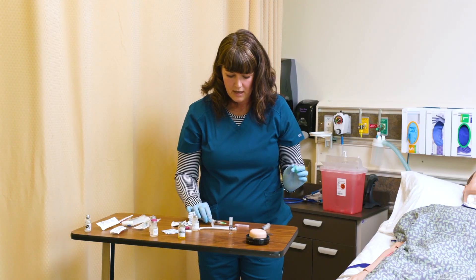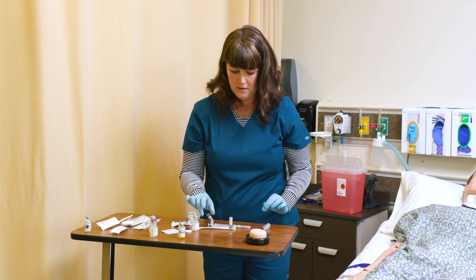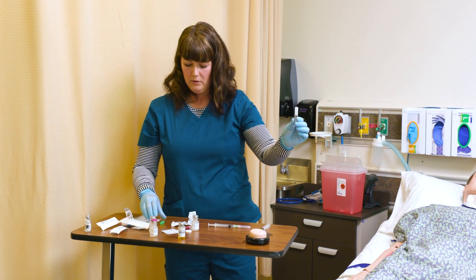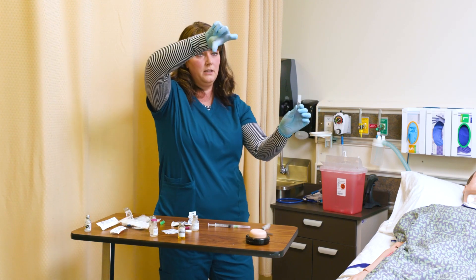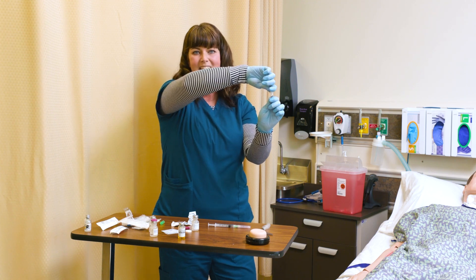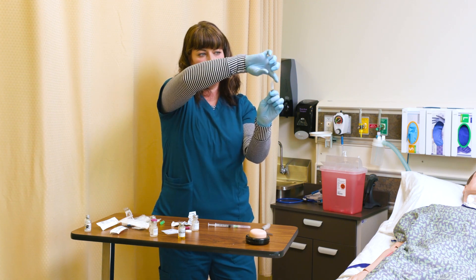I'm going to recap that very carefully and break this ampoule. When you break an ampoule, you want to hold it with your finger up at the top and your thumb above the neck. You don't want your thumb at the neck where it's going to break.